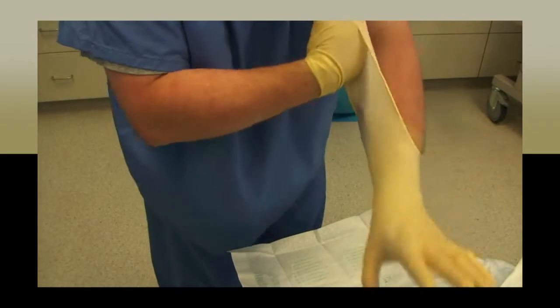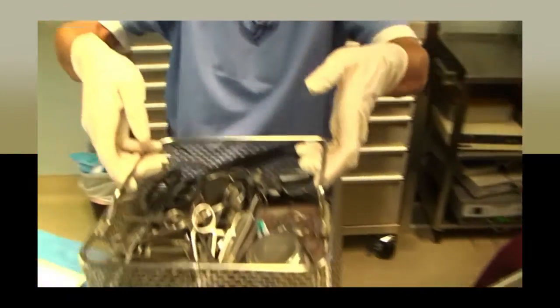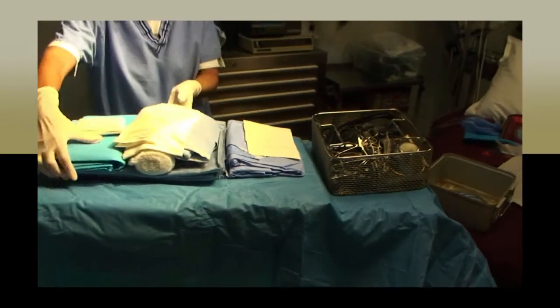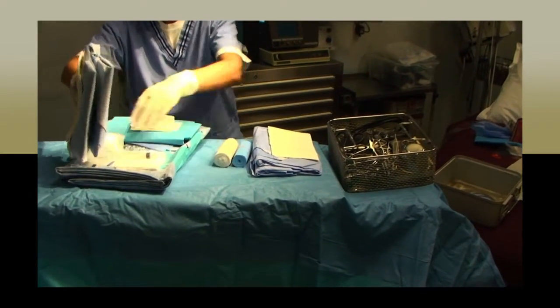You are now ready to lift the sterile instrument tray out of the case and place it on the sterile field. Be certain to stand at least 12 to 18 inches away, and only your sterile gloved hands are over the field. Place the instrument set down, and while gloved, you will now set up the sterile field for the surgeon and scrub assistant.